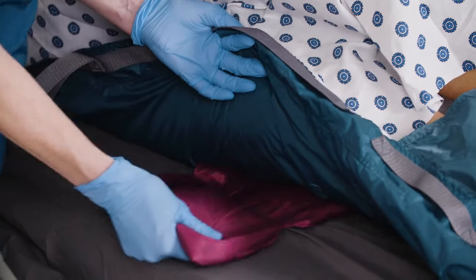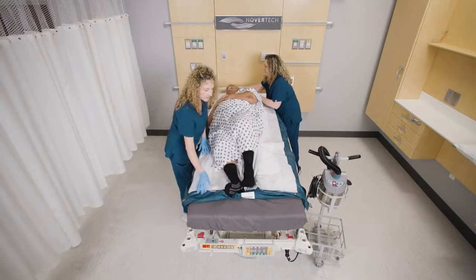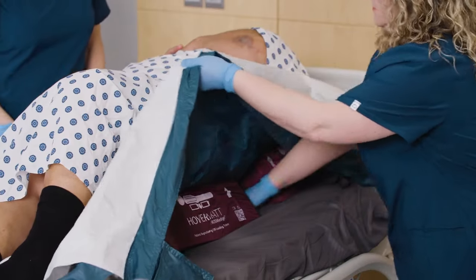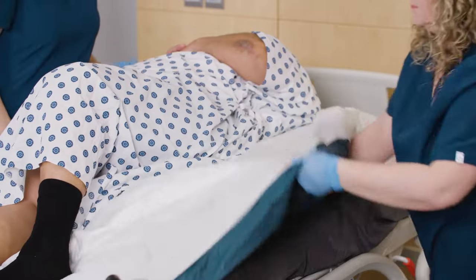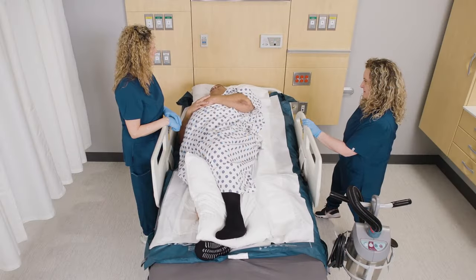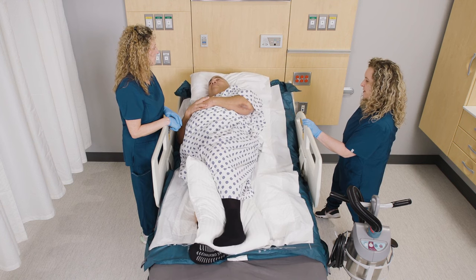Pull the tail through to the other side of the patient to anchor the wedge. After the wedges are placed, make sure the sacrum is not touching the bed — it should be floating. If it is touching, reposition the wedges to ensure sacral offloading. Raise the head of the bed and side rails or follow your facility's protocol.